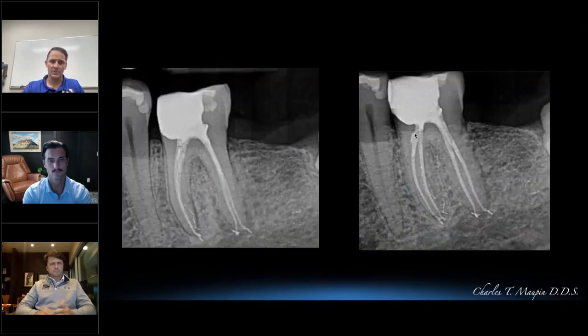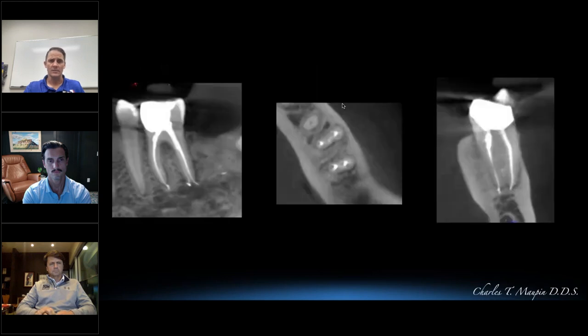And so you can see here on the image on the right, we see that little resorptive defect manifested there, but we've got fill to the canal terminus. We got a little accessory canal coming off in the apical third on the mesial root there. We did, again, a little gingivectomy on this one to aid with restorative treatment there. So pretty conservative shapes, but not the super conservative that I once was doing with 1403s. I kind of like this 2004, 2006, the V taper file as well on these cases there. Here's the post-op CTs going on. You can see the accessory canal there, manifest there as well.